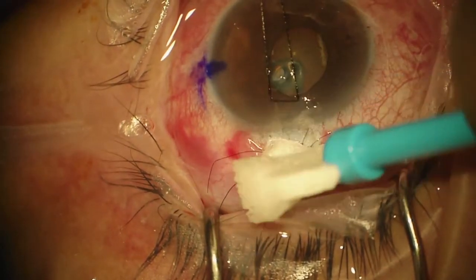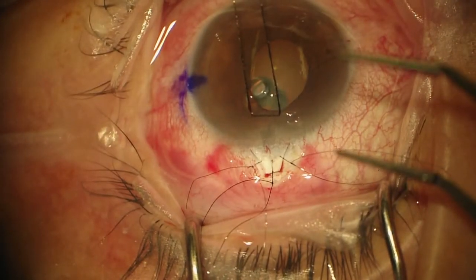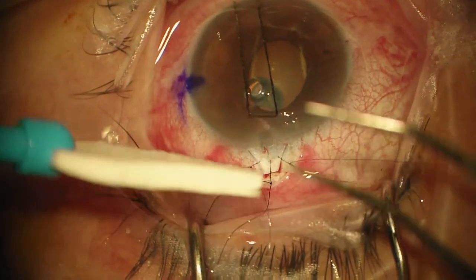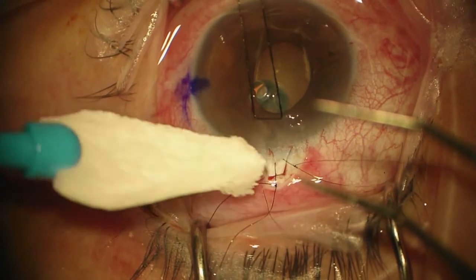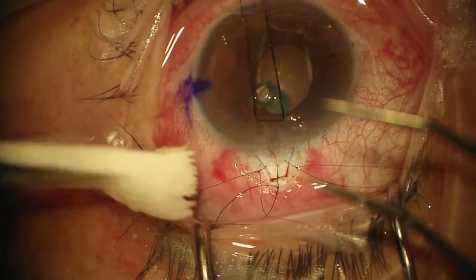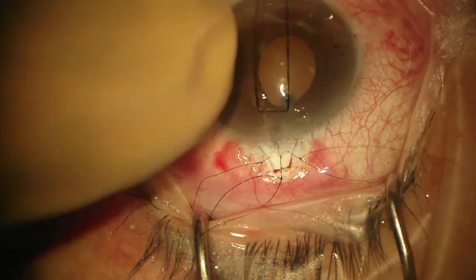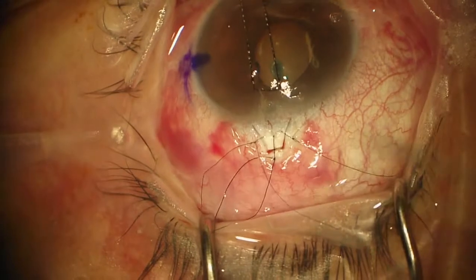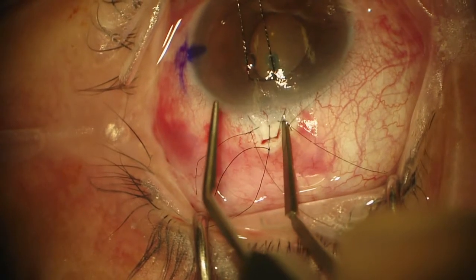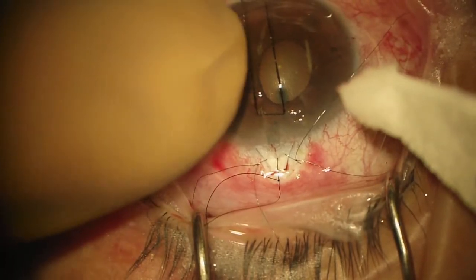I can loosen my stitches. Let's see how much is flowing just by loosening that one stitch — quite a lot. I'm going to see how firm the eye feels. Still a little bit firm. Let's see how the flow goes and where it settles down. I can loosen this one a little bit too. And that seems pretty good.